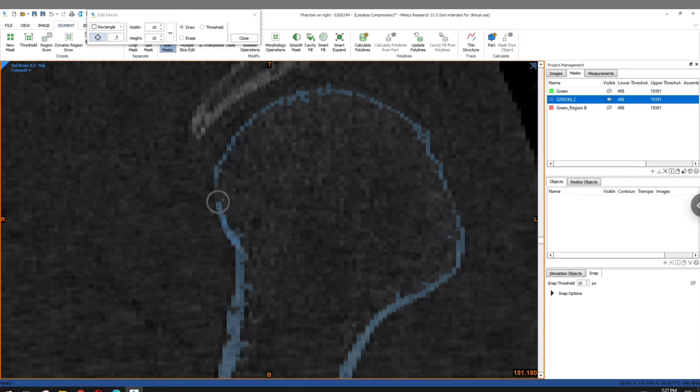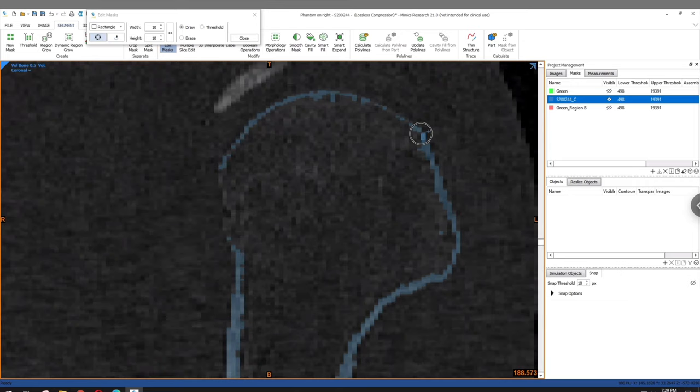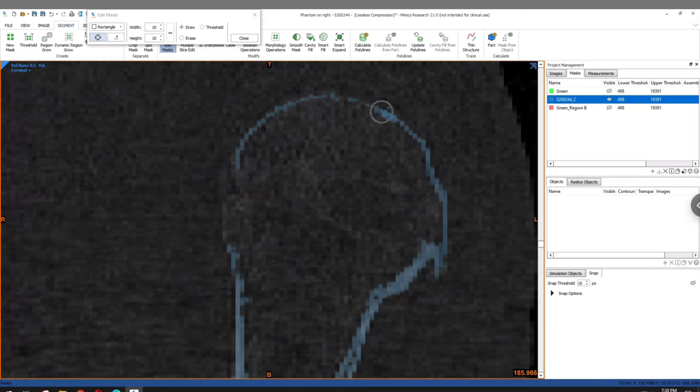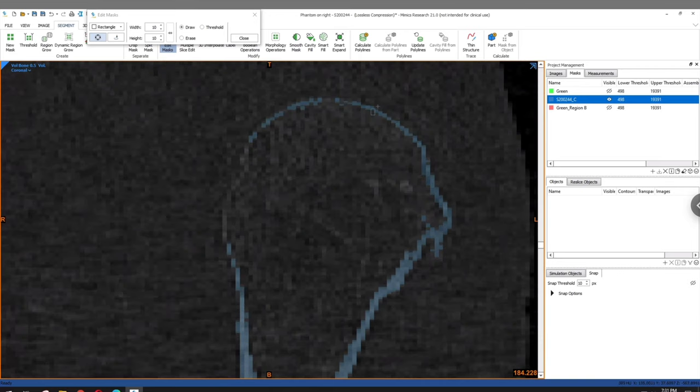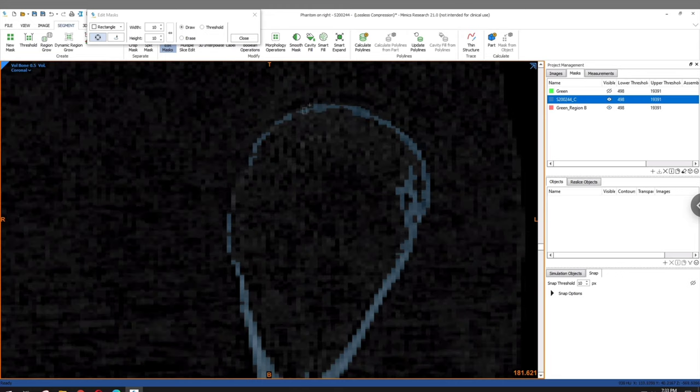So I'm just going to speed through all of this so you don't need to watch the process completely. Although this is by far the most tedious step in this entire process of developing a 3D model from CT scans, it is also possibly the most important.